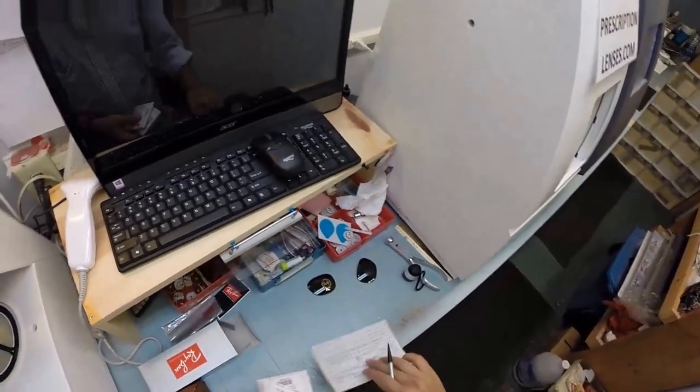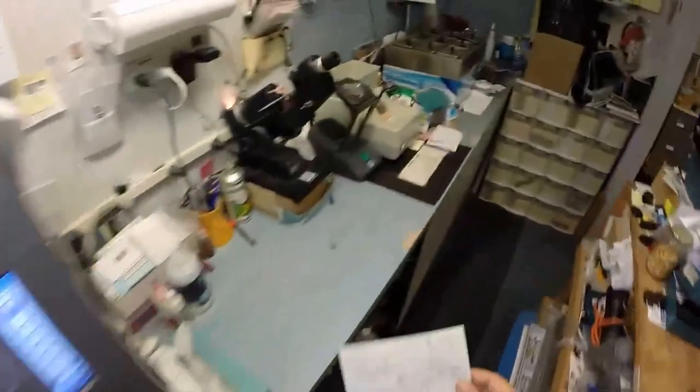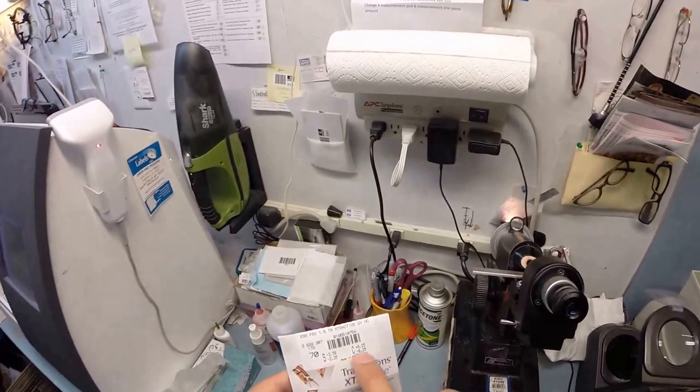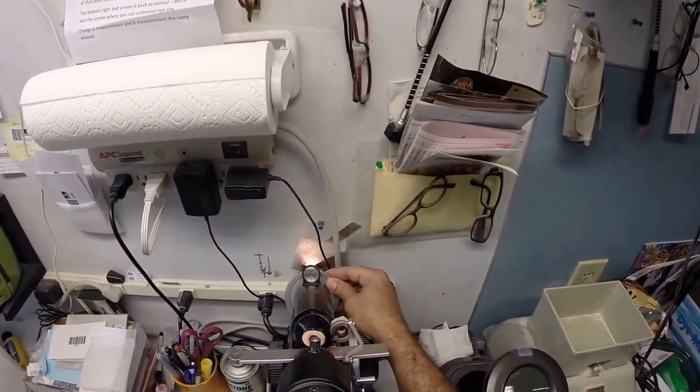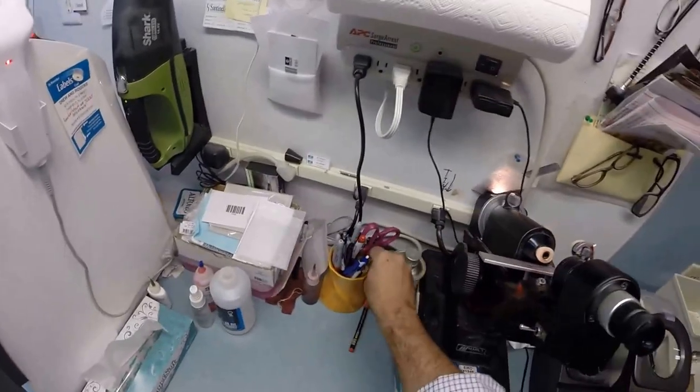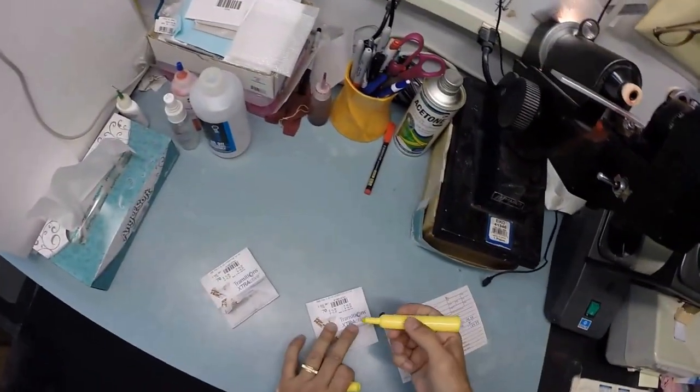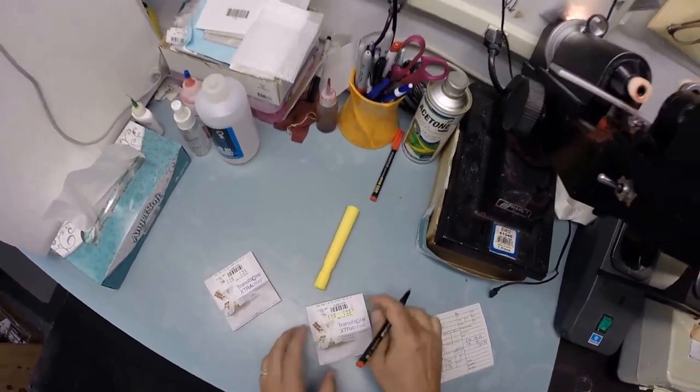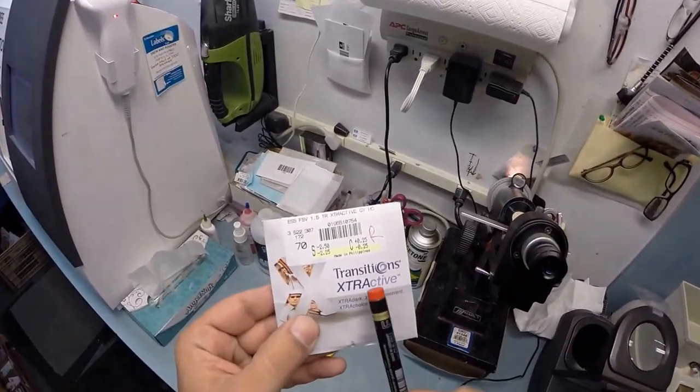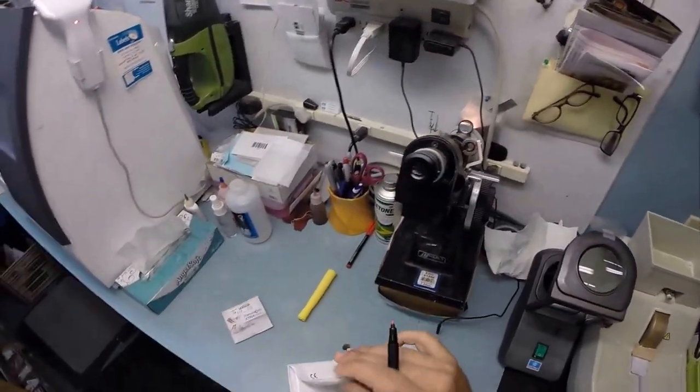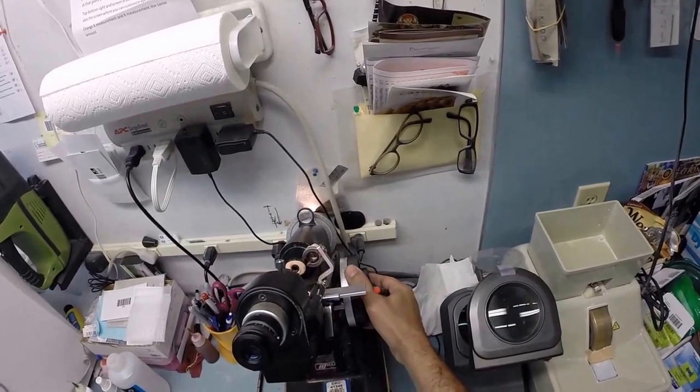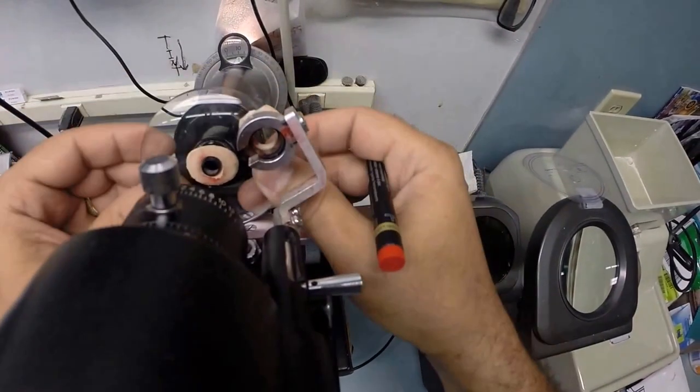Your right eye reads minus 2.25, minus 0.25 at 10. I'm gonna put the axis wheel of my Marco 101 lensometer to 10 and let me get my stylus out. This is going to be your right lens. You're going to receive all the manufacturers original packaging - that is the right - so you know you are receiving Essilor brand transitions extra active. I'm gonna take the lens out of the protective packet, put the power drum on minus 2.25.